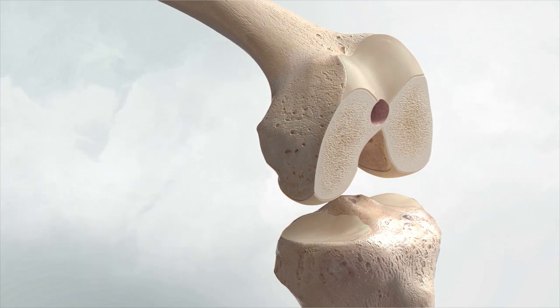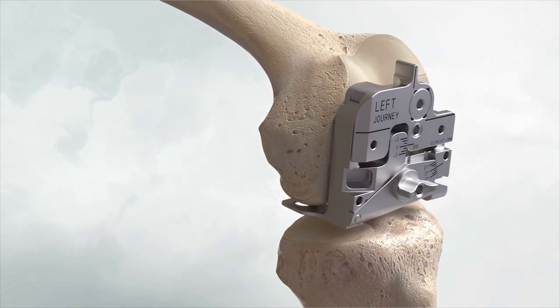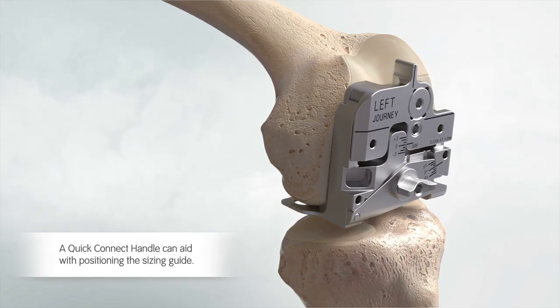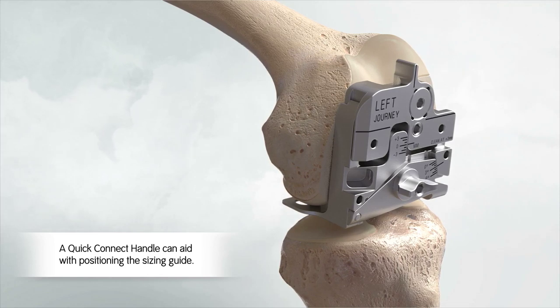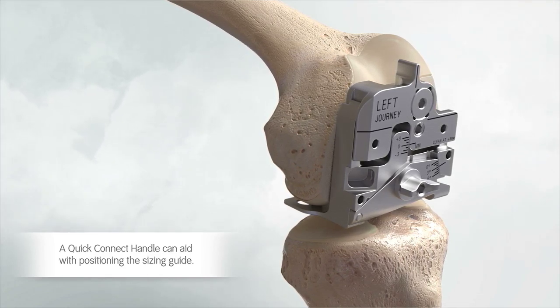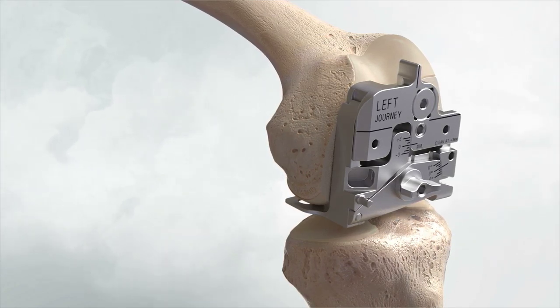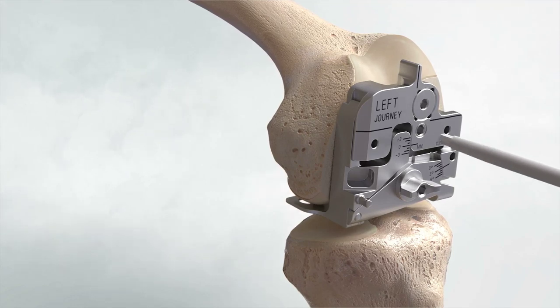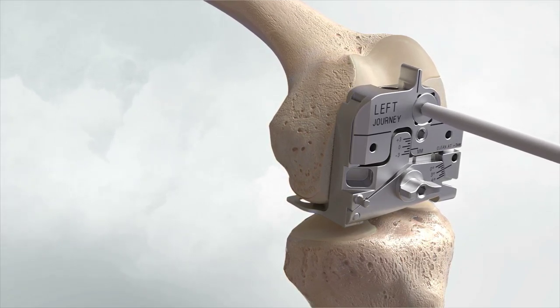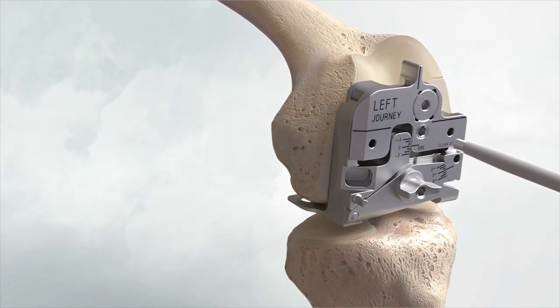Place the left or right Journey 2 DCF sizing guide on the resected distal femur. With the medial paddle mated to the posterior medial condyle and the sizing guide flushed to the distal resection, place a 45 mm headed speed pin through the hole just above the medial paddle. This will secure the sizing guide for the remainder of its use. If there exists a known flexion-extension imbalance, unlock, translate, and relock the drill guide appropriately.